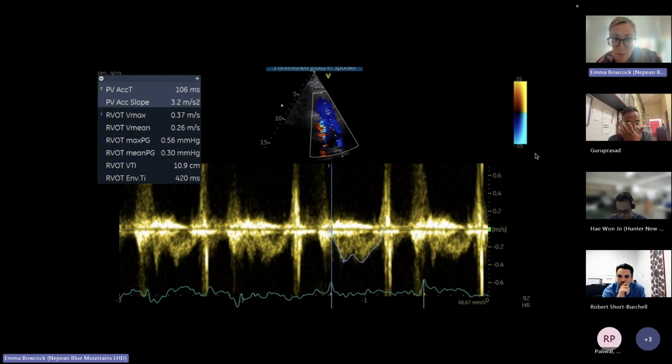to diagnose it. I guess you have a very high pretest probability when you find mobile thrombus, and often these patients are more unstable. So sometimes you have to go only with echo, and do the best you can with what you have, when you have unstable patients.